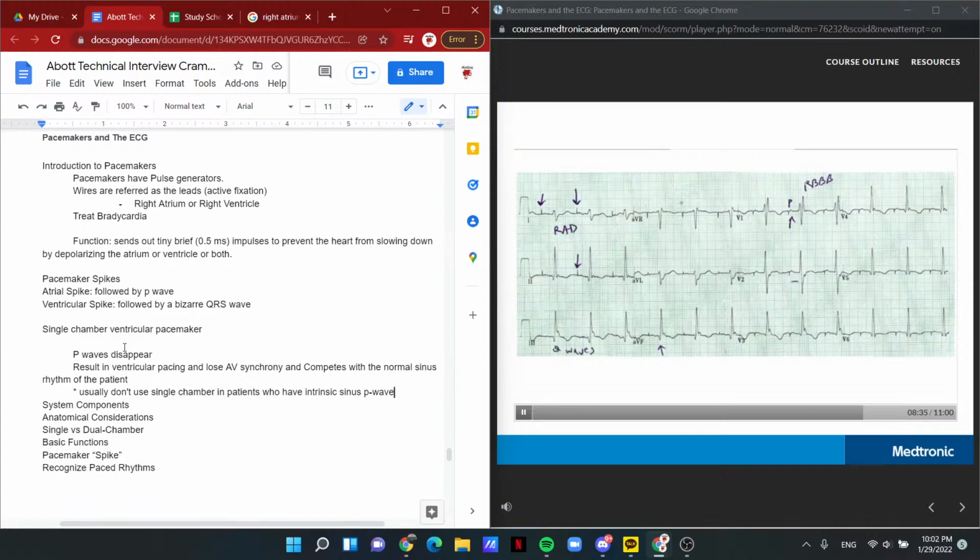But the point is the pacemaker is functioning in the atrium, and it's making up for someone who perhaps had sinus node dysfunction and had sinus bradycardia. Atrial pacemakers can restore normal atrial rhythm, and they don't necessarily need to pace the ventricle if AV conduction is intact. So this would be read as an atrial paced rhythm with a first-degree AV block.